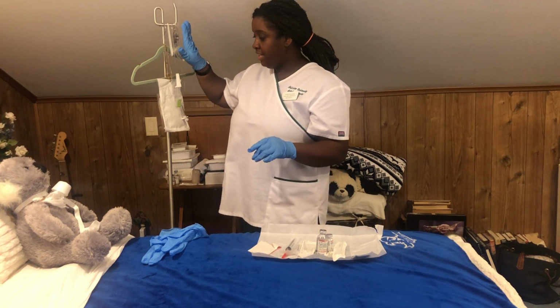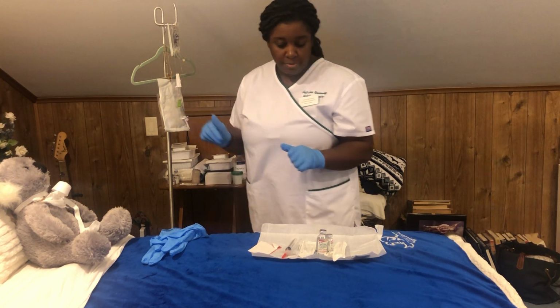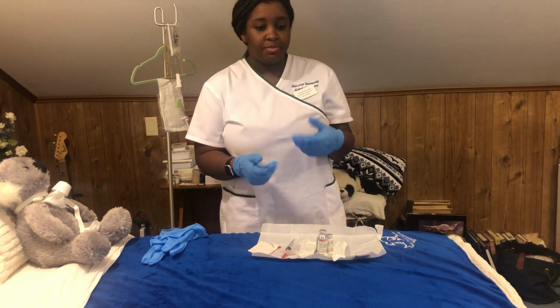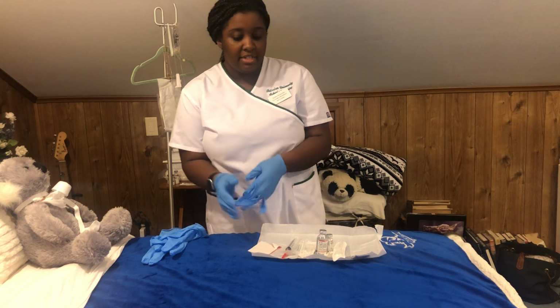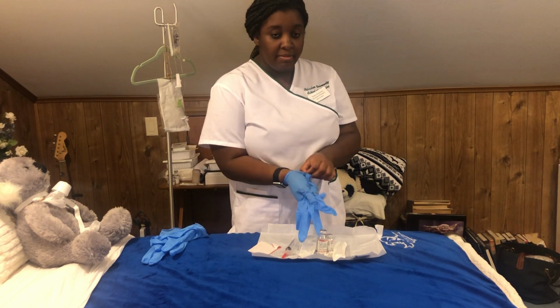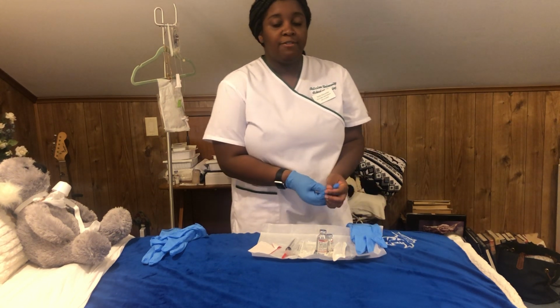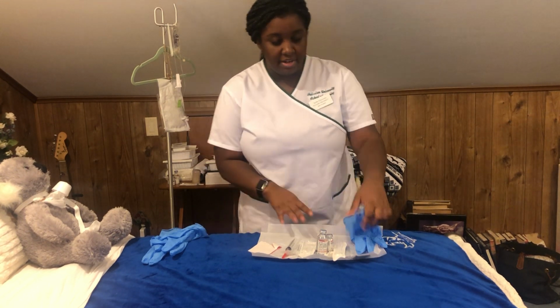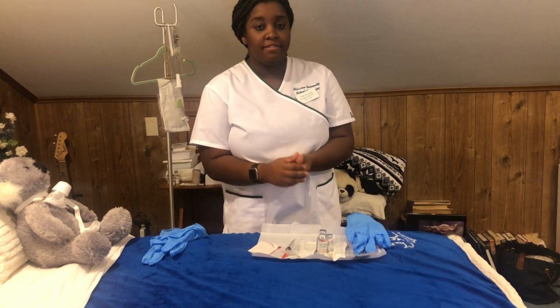The new medication is at the top, the other one is down below, and I will then perform hand hygiene, tidy up my area, and document that I've performed the task, and inform the patient if anything is needed. Please let me know. And that ends my video.